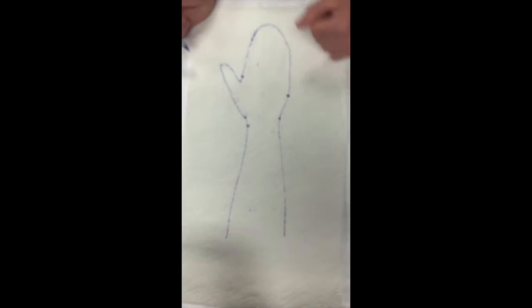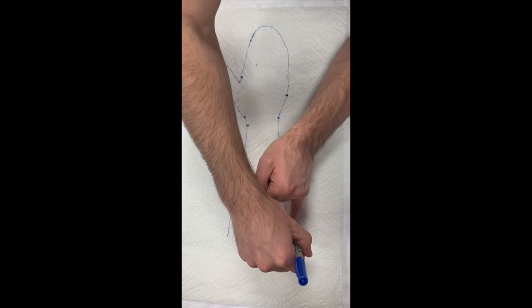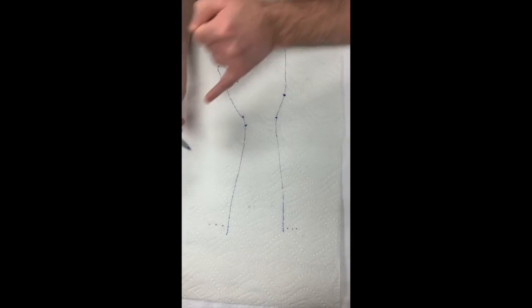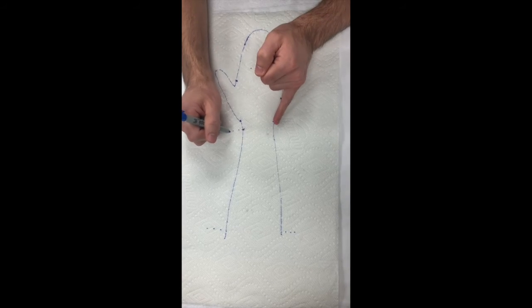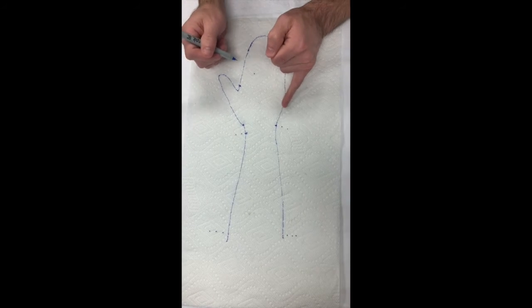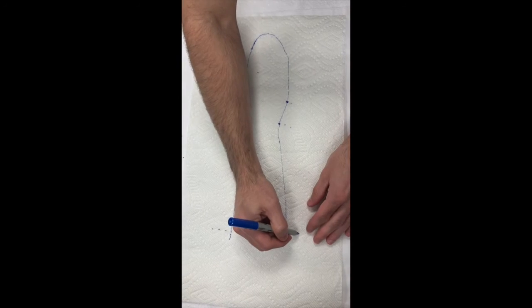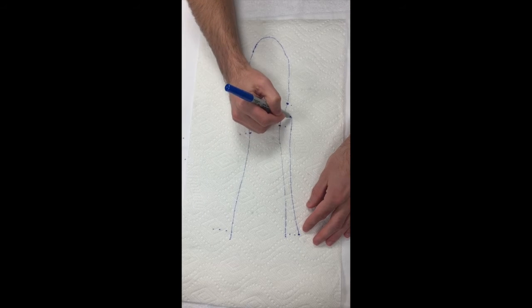Two inches from the elbow crease, mark 3 finger widths apart from that landmark. Mark 2 finger spaces from the radial styloid as well as the ulnar head. 1 just proximal from the 5th MCP joint and 1 from the thumb web space. Connect your dots.